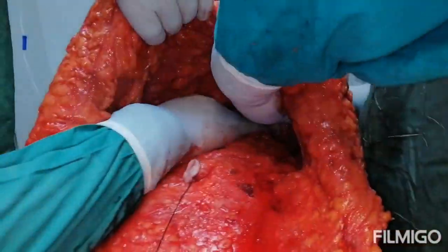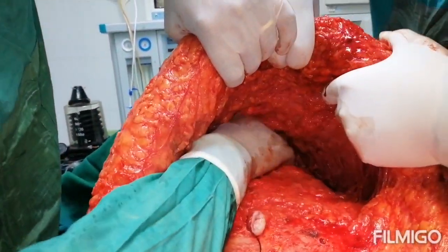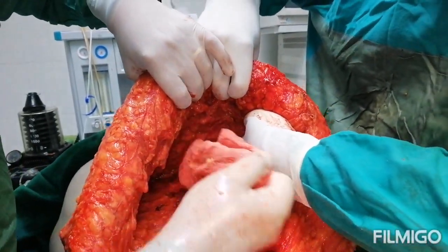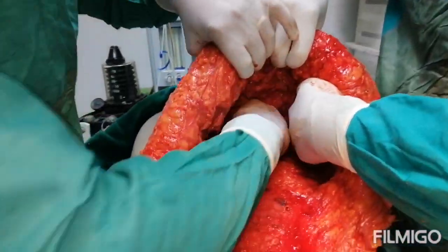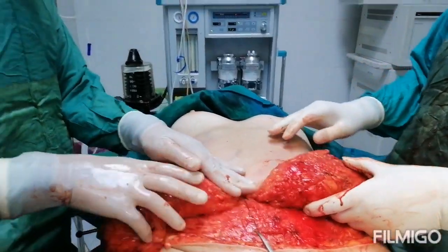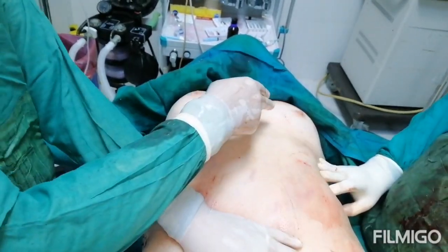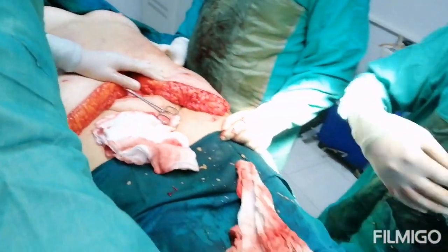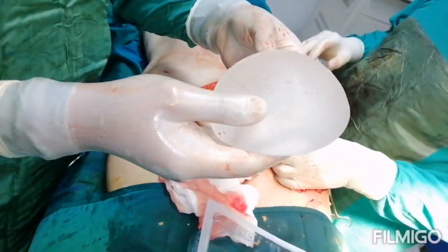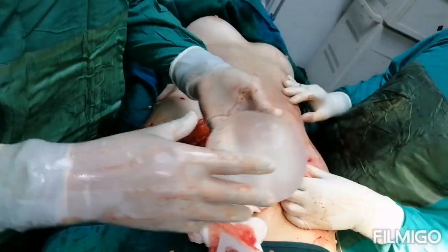As you can see, this is the place and this is the pocket. We go now to put the implant. As you compare, you look at both breasts — this one has two towels inside it and this one has none. Now we will start to put the implant. This is a 450cc silicone high-profile implant. As you can see, this is the base of it and this is the projection of it.